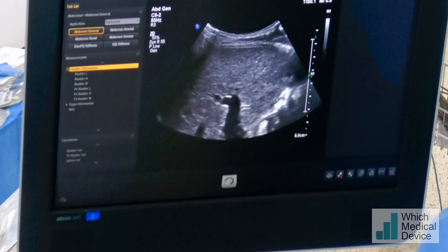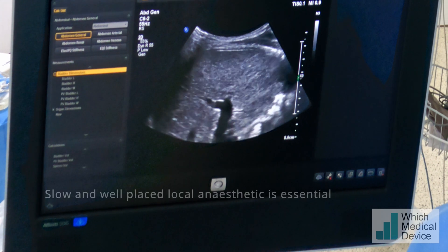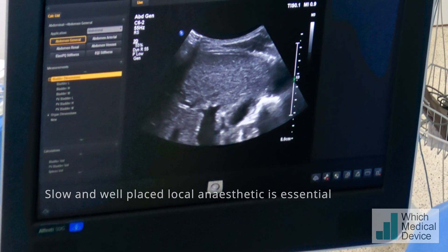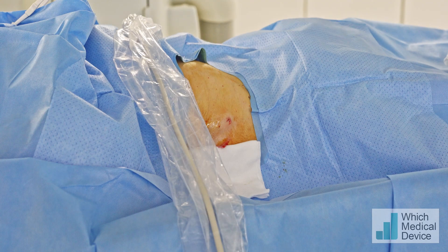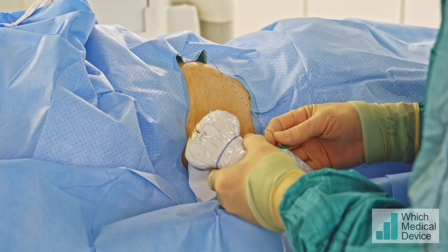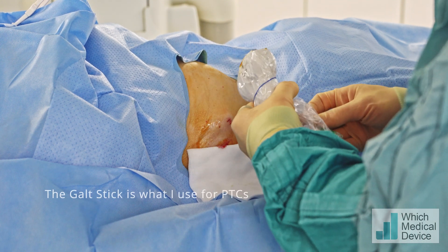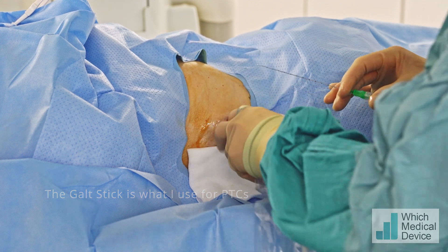We're getting down to the capsule — just stop breathing for a moment. Now breathe gently. This is essentially like a PTC, but we're going to be using a 21-gauge Galt stick needle to access the portal vein with an 018 guide wire, and then the rest of the Galt stick is going to go in over that.